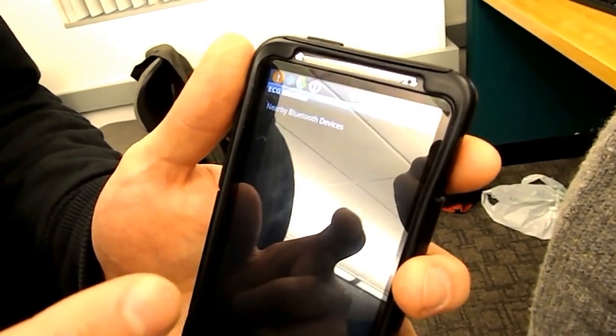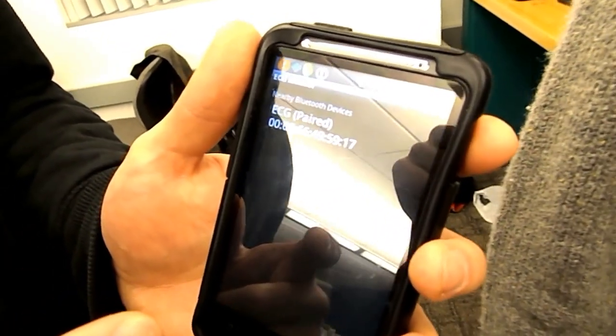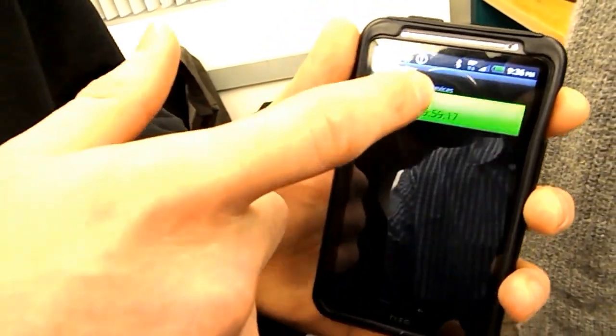Go to Bluetooth. It will search nearby Bluetooth devices. ECG is our device. So we will connect. And it should turn green.